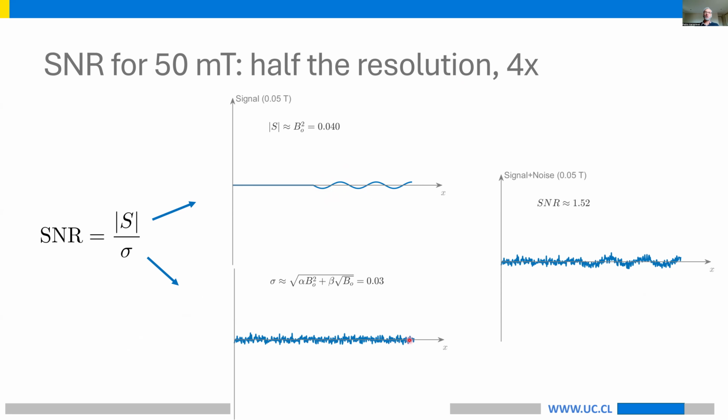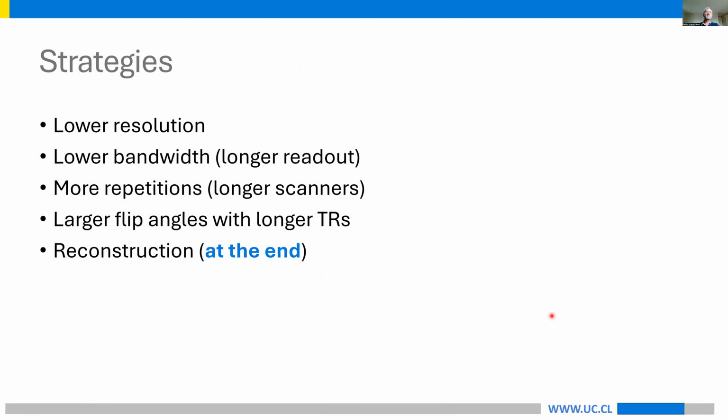The noise increases also, but you can begin to see the object within this noise. So you will see that all the images acquired with this low field are typically low resolution because you need to take care of this signal to noise ratio.